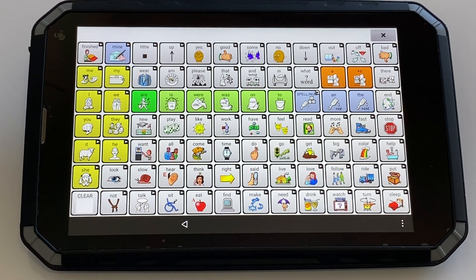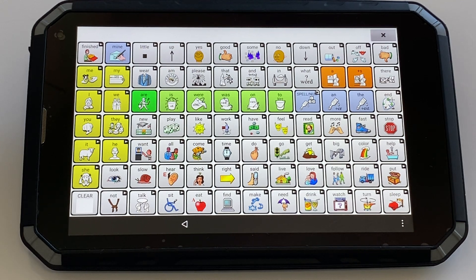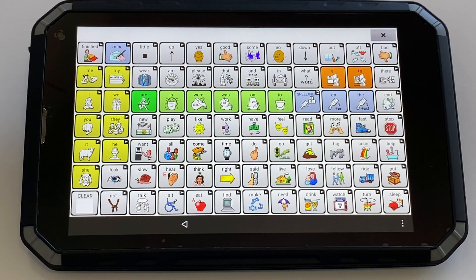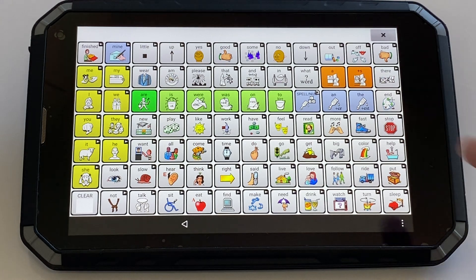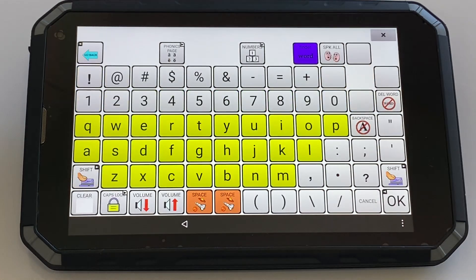Here is how you use and turn on the word finder feature. Word finder is designed to show you the pathway to specific words, so if you need to know where a word is in the device you can use this tool. In LAMP, you can find the word finder under Spell/Num, and then you can see word finder up here in purple.